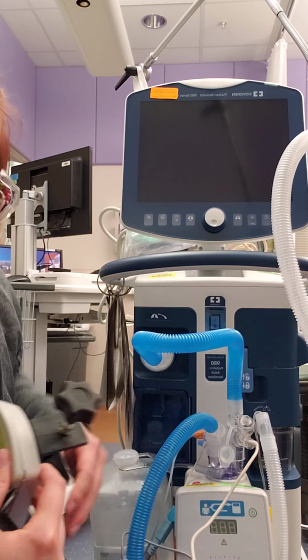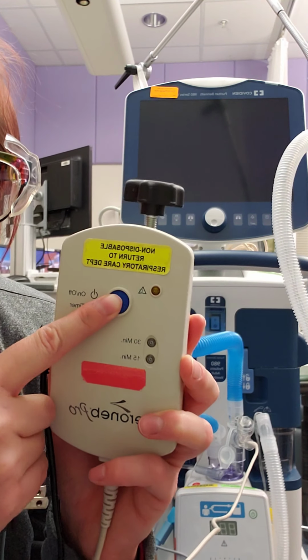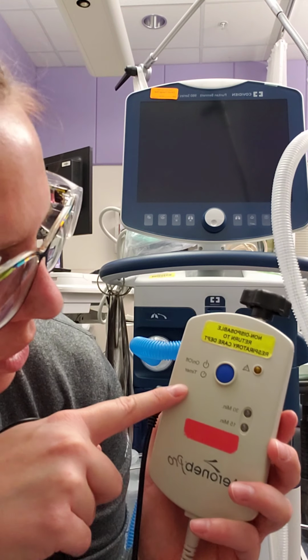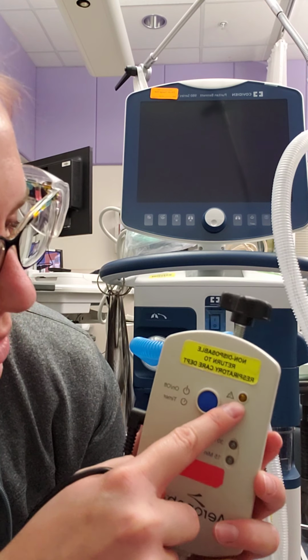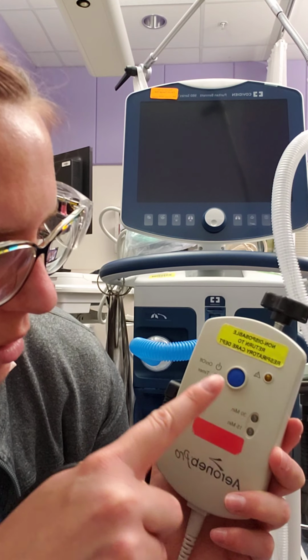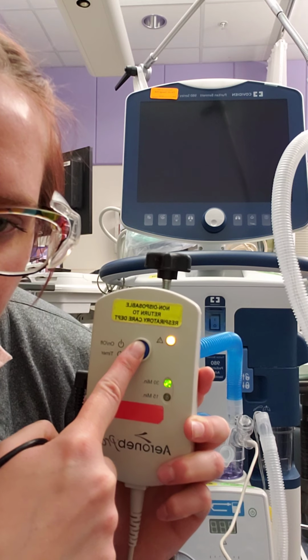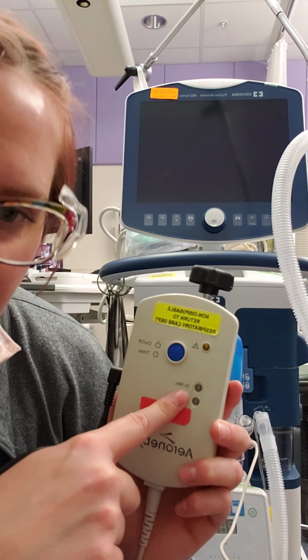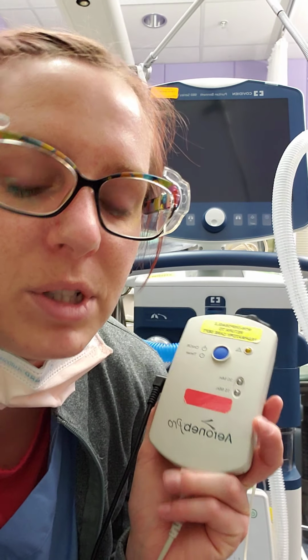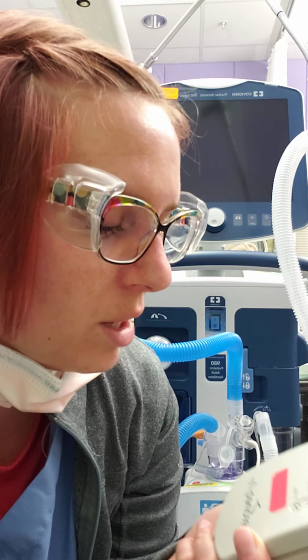Plug it in there, and then you push this button to make it start. Sorry, I don't have it plugged in, so it'll say on or off, and you can tell that by the little light here. And then it will either run for 15 minutes, or if you hold it down, it'll go to the other length of time, the 30 minutes. Or there will be times you will set up continuous, and it will just continuously nebulize until you shut off the equipment or break it down yourself.